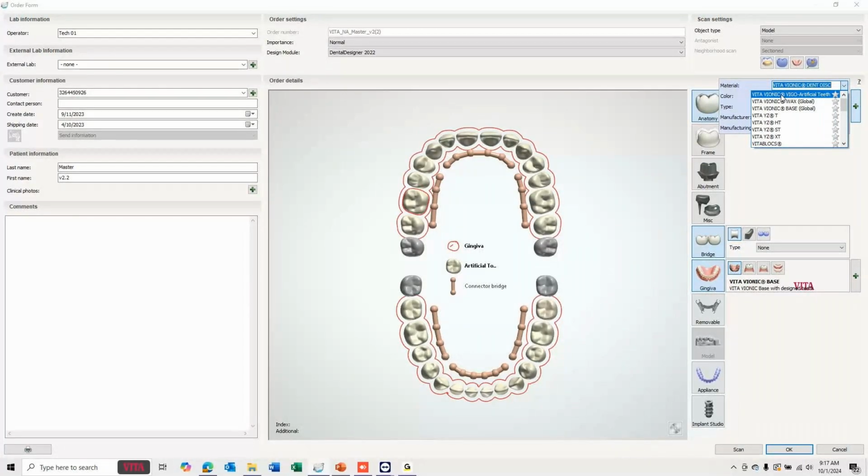And I get people that ask me from time to time, oh, can I demo it or preview it? And the unlocked version of the library, it's either locked or unlocked. So there's not really a good method to give temporary use. So actually just downloading and using the free library is a great preview because all of the tooth molds are the same, all the setup is the same. You just can't export the teeth at the end when you're done. Okay.